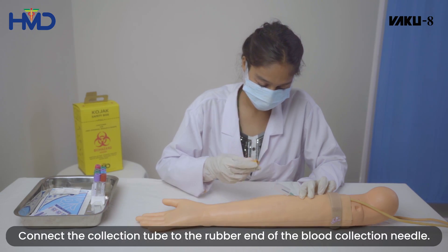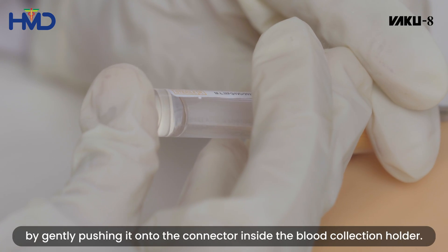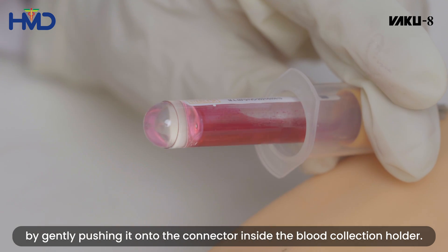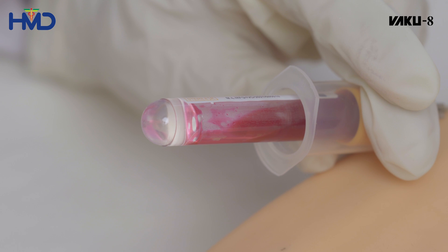Connect the collection tube to the rubber end of the blood collection needle by gently pushing it onto the connector inside the blood collection holder. Allow the blood to flow into the tube using vacuum until you have obtained the required amount.